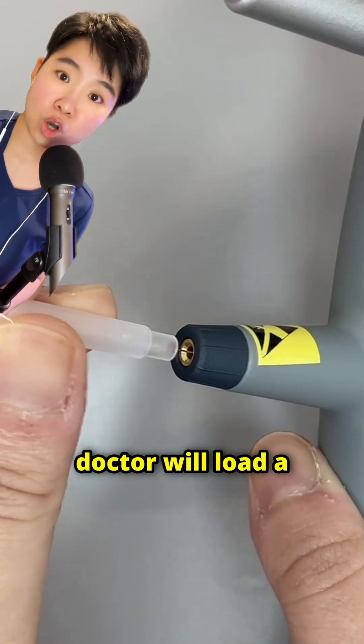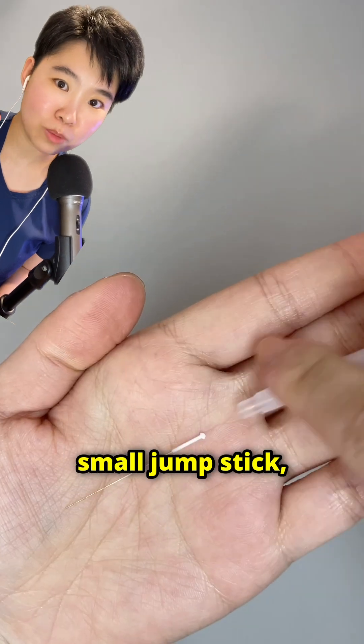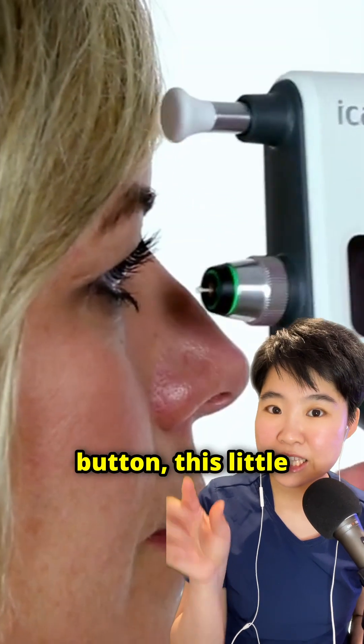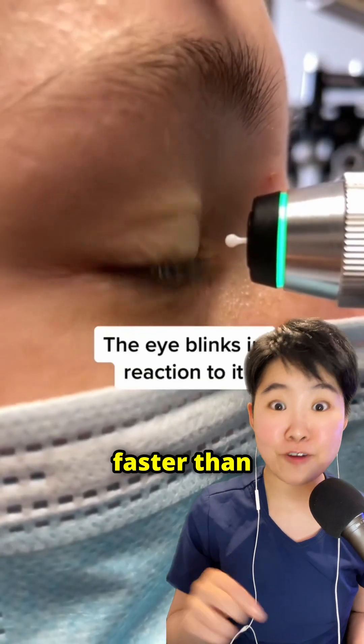To prepare for measurement, your doctor will load a disposable probe into the device. The tip is like a small jump stick, and the shaft is a piece of magnetized steel wire. As your doctor presses the measurement button, this little round tip makes contact with your eye and bounces back super fast — faster than you can blink.